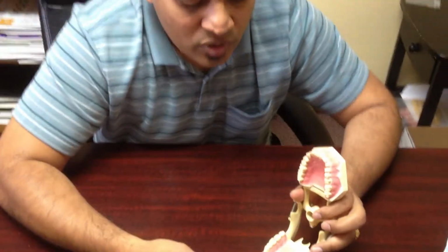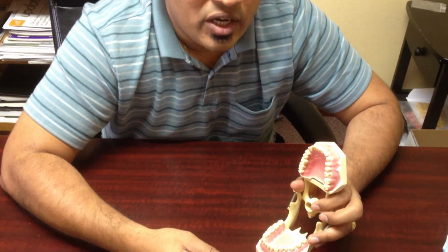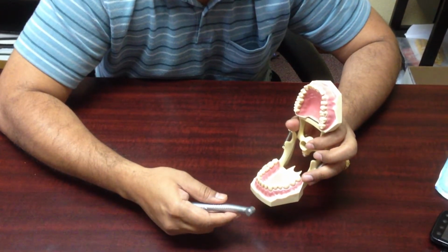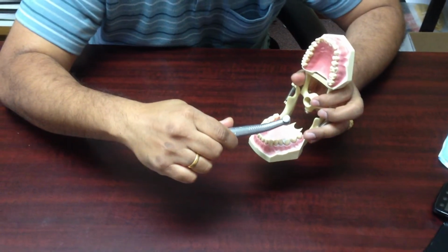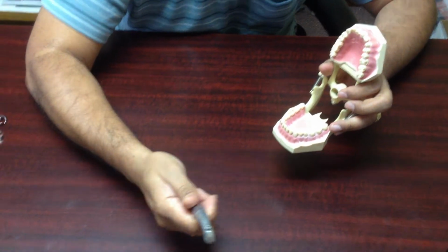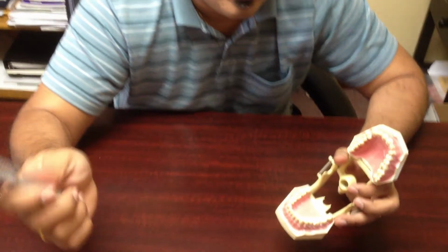What I am trying to come up with is something called a CAD cam system, where right now we have the technology where a camera that kind of looks like this, you take a picture of this tooth, and the camera or the machine will make a filling, a porcelain filling. It'll cut a filling out of a piece of porcelain.